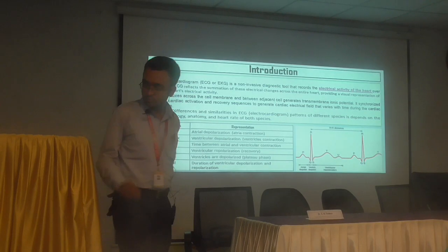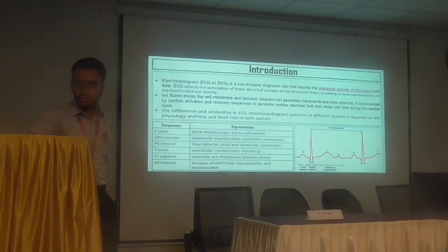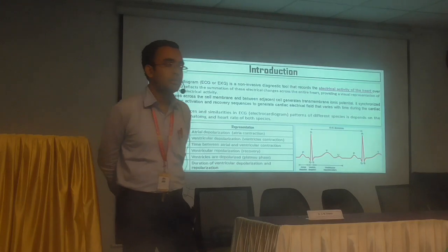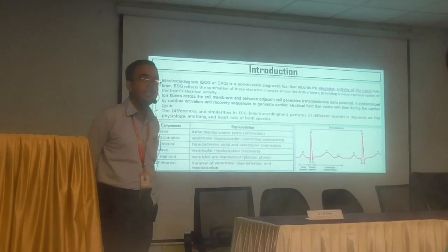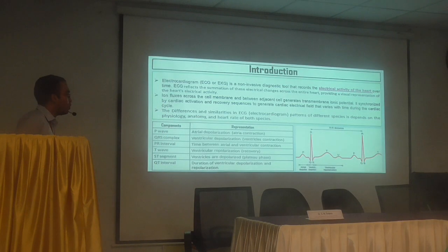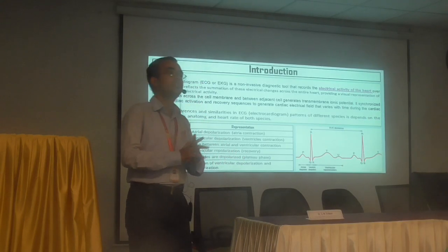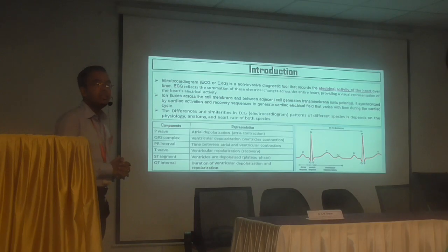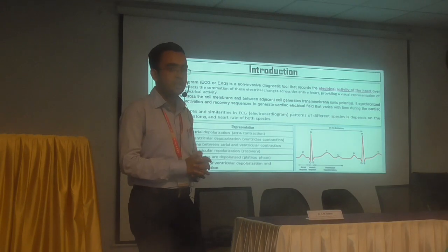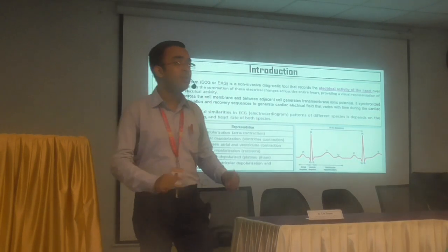What is the U wave? That is the U wave. U wave generally denotes the repolarization of the Purkinje fiber or bundle of His. Okay. Repolarization of bundle of His, but sometimes it occurs. Even Somnath sir yesterday discussed the U wave. So any type of abnormalities in the ventricle are denoted by the QRS complex, as well as in case of ventricular tachycardia.